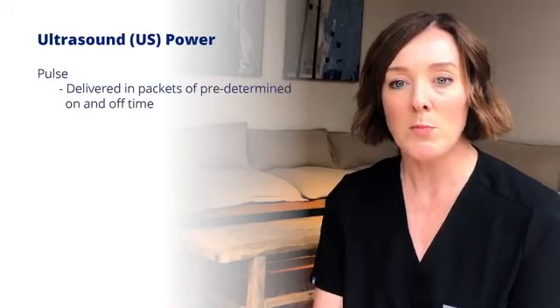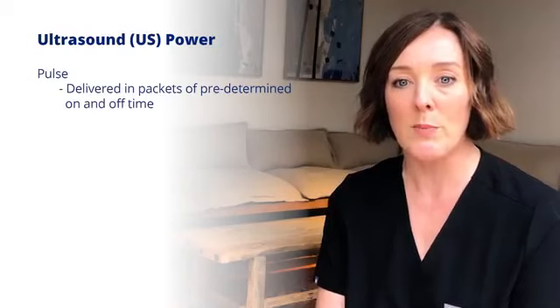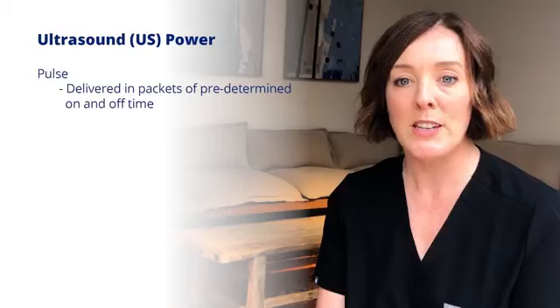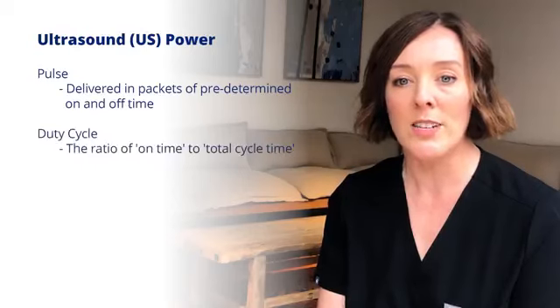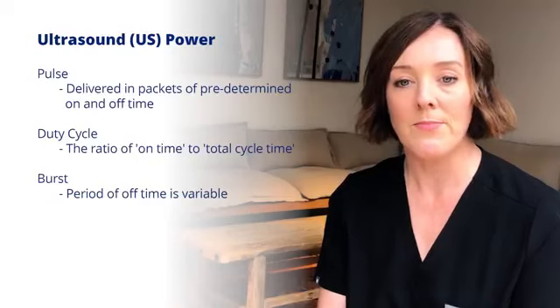Different modes are possible to modulate this ultrasound energy. In pulse mode, energy is delivered in packets of predetermined on and off time. Pulse allows fluidics to work between pulses and allows heat to dissipate. This leads to better followability and less chatter. The duty cycle is the ratio of on time to total cycle time. Burst mode is also an energy modality, but the period of off time is variable and can be adjusted.